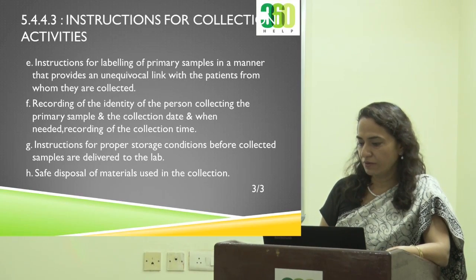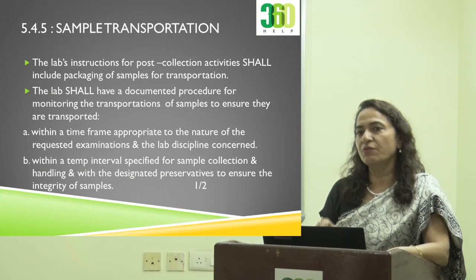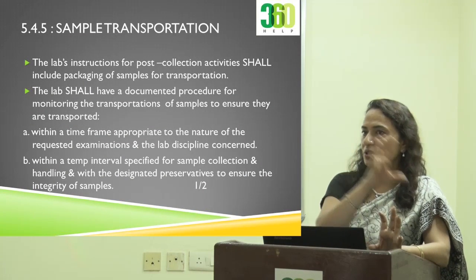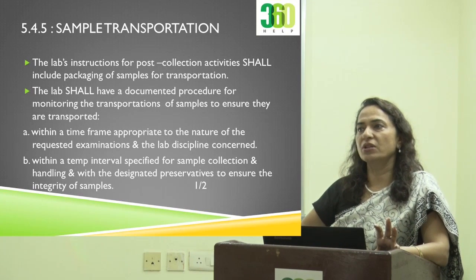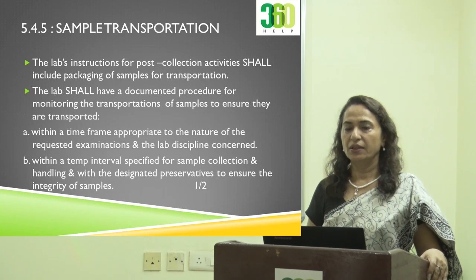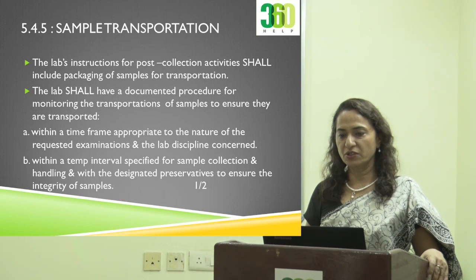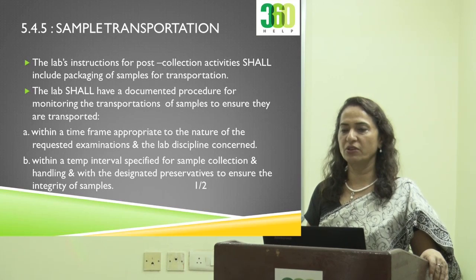Safe disposal of the collection material. So basically all these instructions are for whom? Your own sample collection person. There are instructions for the patient, which we discussed, TRF we discussed, then instructions for your own employees: pre-collection, at the time of collection, what are they supposed to do? Then comes transportation. 5.4.5 is transportation. Lab's instructions for post-collection activities shall include packaging of samples for transportation.